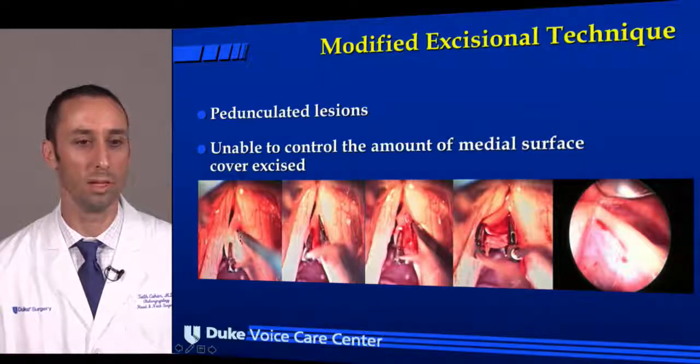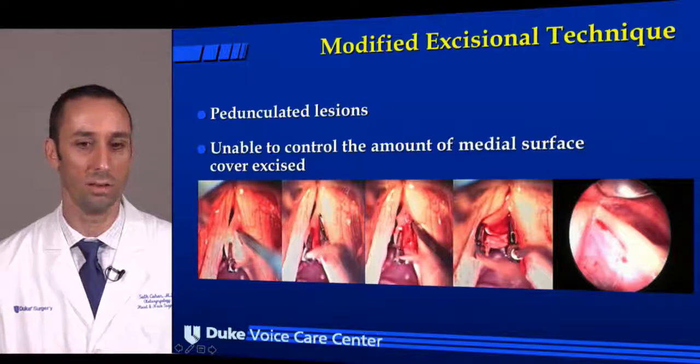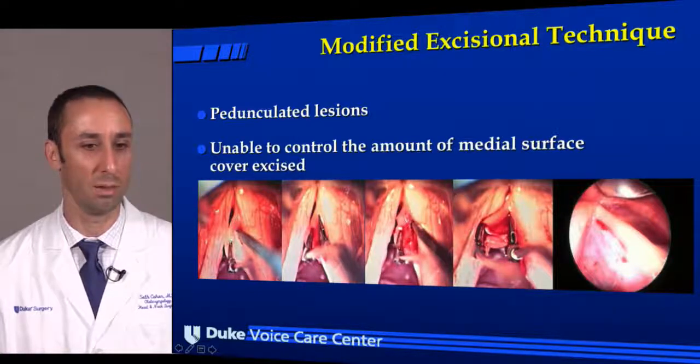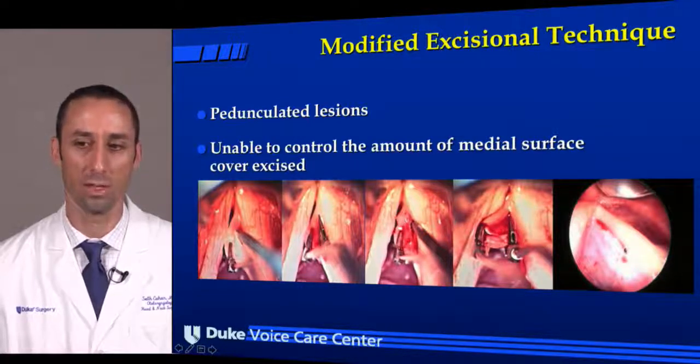So we make an incision along the medial edge. I get my little dissector in there again. Open up this area. This is just extending that incision a little bit more along the edge of that vocal fold. Freeing up this tissue. And I know that I'm going to have excess inferiorly based flap. I know that this polyp is filled with vascular gelatinous material, and I can tease that out, creating an inferiorly based flap, and then I can excise, as shown in this picture here, excess flap in that diseased lamina propria, so that I'm left with a straight line incision.